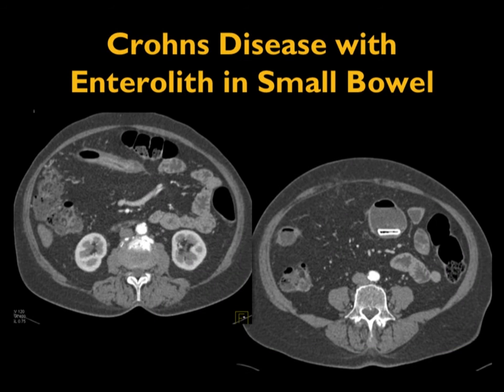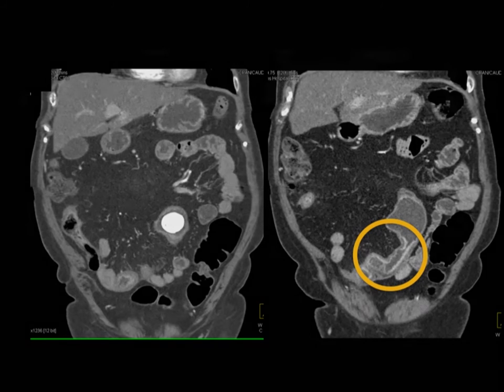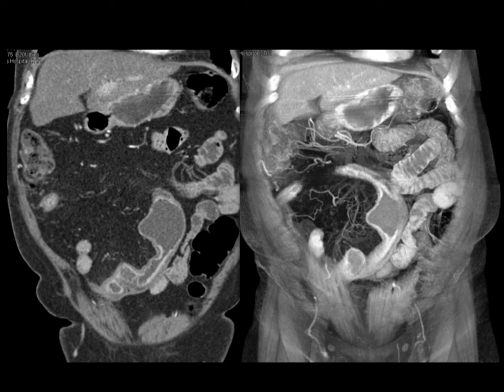When we talk about the transition point, here's an example of a bowel loop with an enterolith present. The bowel loop is dilated, but in the coronal view you have a better understanding — you see the enterolith, the large calcification, and the stricture in the patient's small bowel. The ability to see specific points like strictures is best in a coronal perspective, and when you go from coronal to 3D volume rendering it's particularly ideal. You see the hyperenhancement of the mucosa and the stricture — all critical findings in patient management.